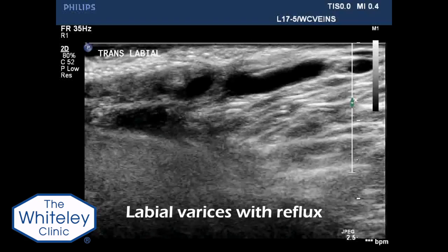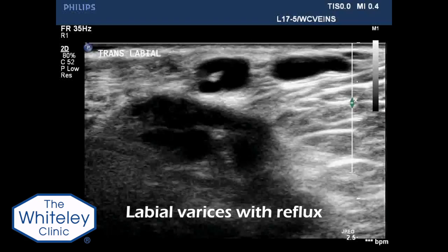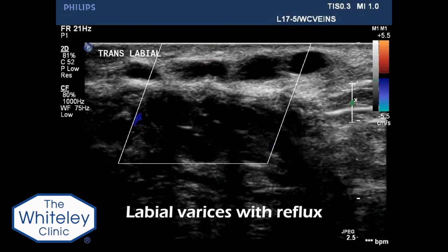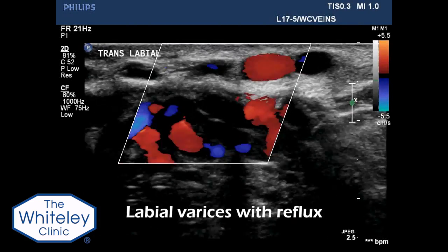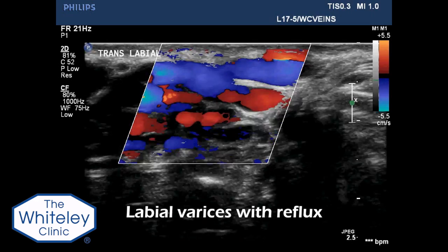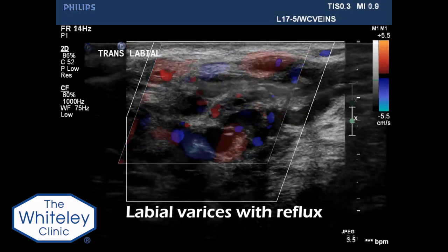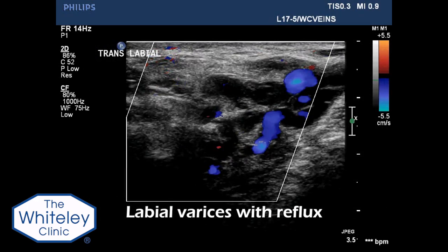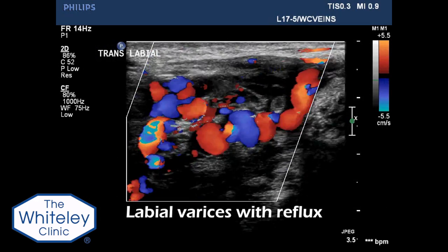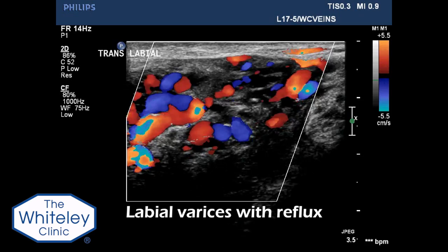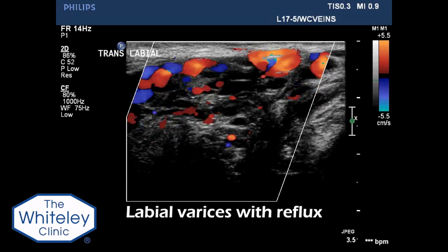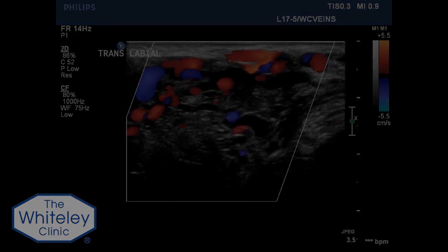Translabial imaging identifies large labial varices which display gross reflux. This patient had symptoms of pelvic congestion with irritable bladder and bowel, small haemorrhoids, and gross symptoms within the labial veins.